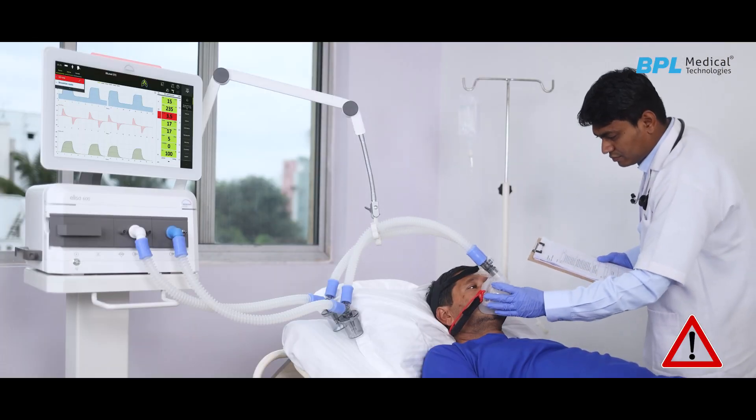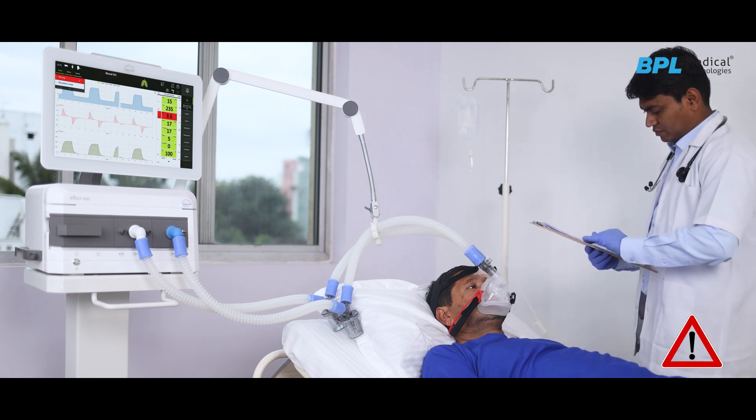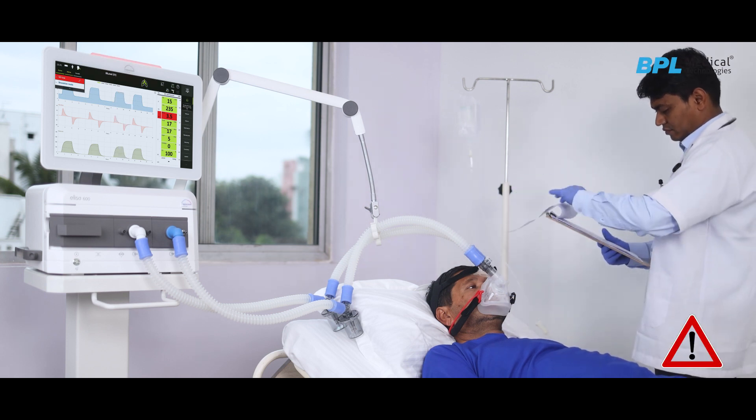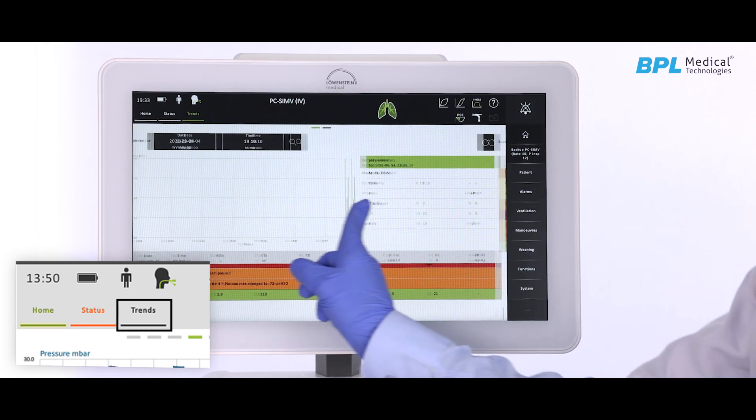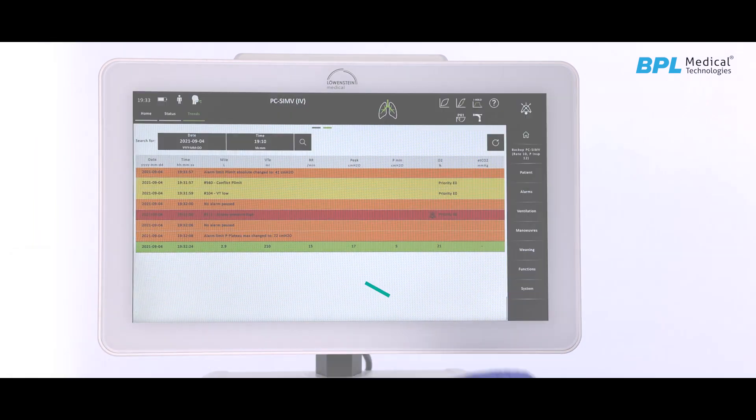The eye-catching traffic light on top of the display will alert clinicians at a distance. By pressing the trend icon, all recorded alarms and trends can be viewed with time and date.